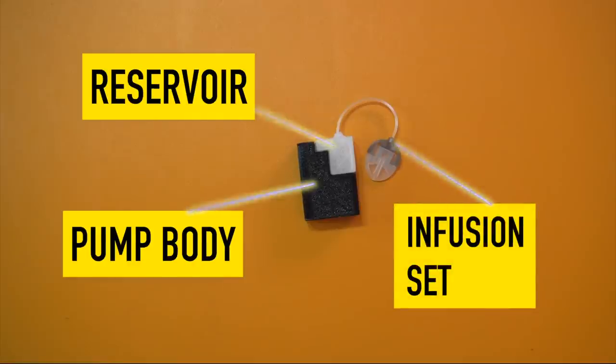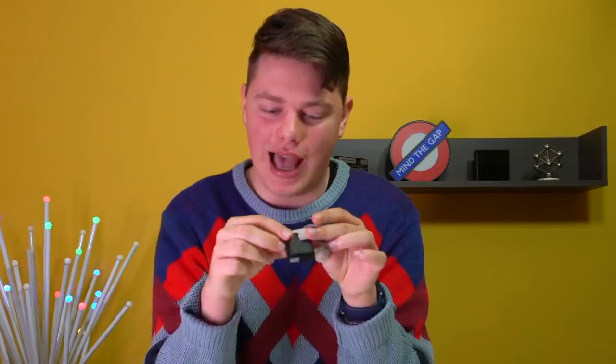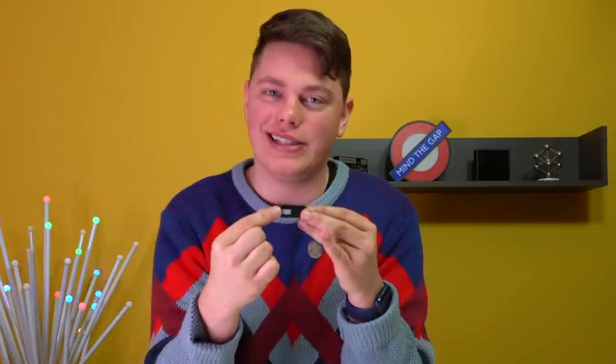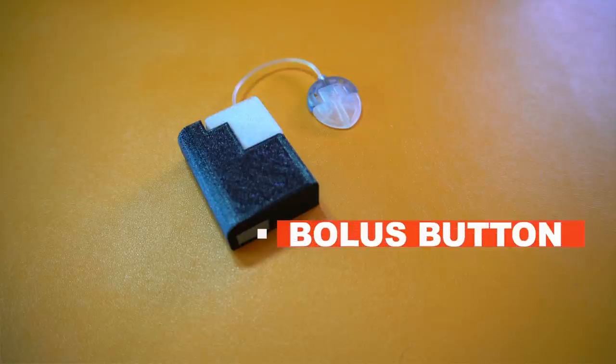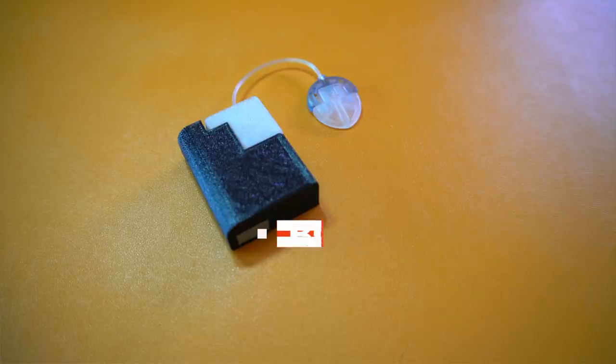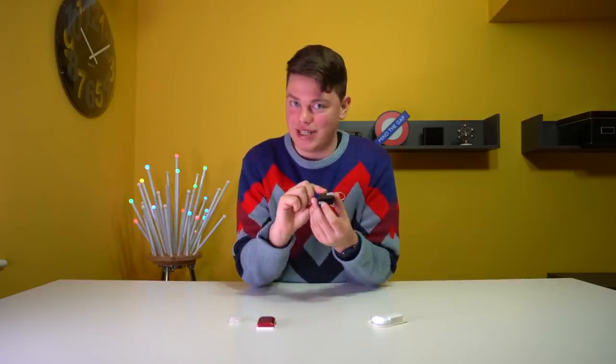The same process applies to the T-Sport insulin pump — you just change the infusion set and the reservoir. The T-Sport will hold 200 units of insulin, and it has a great little feature at the bottom: a bolus button. The T-Sport will actually allow you to bolus without your phone, directly on the pump itself, just by pressing this little button.